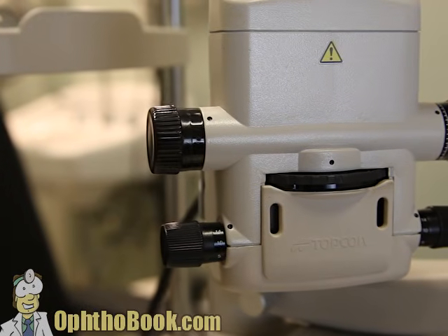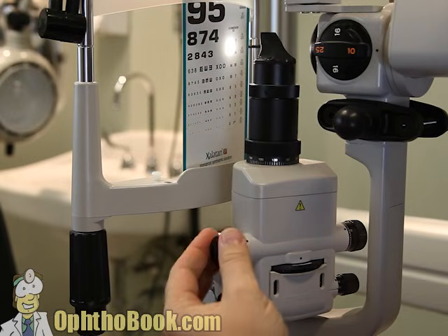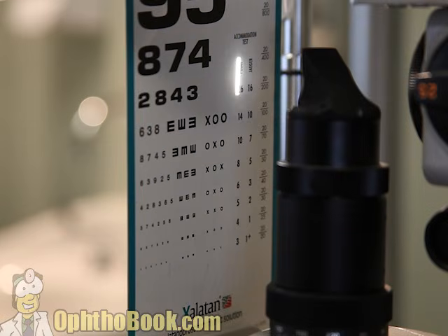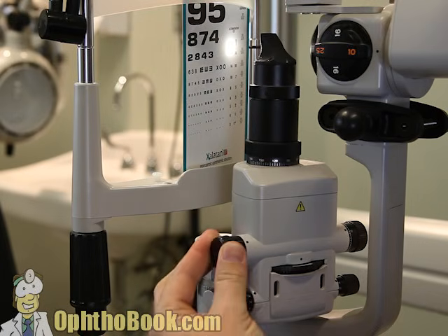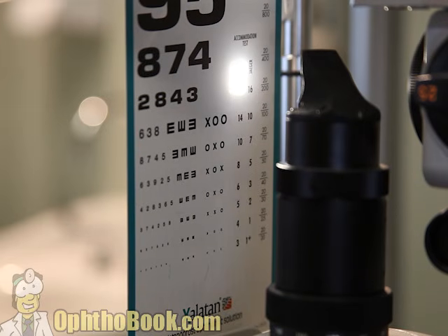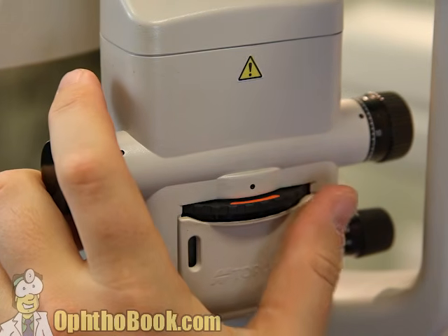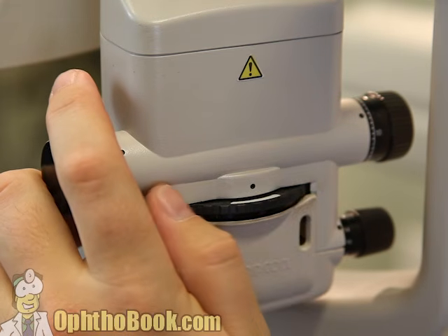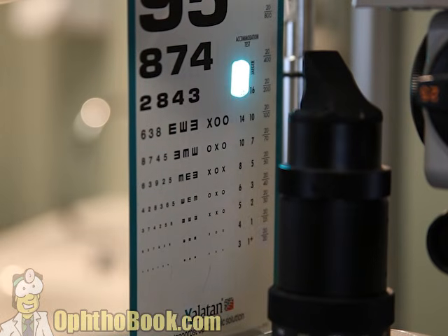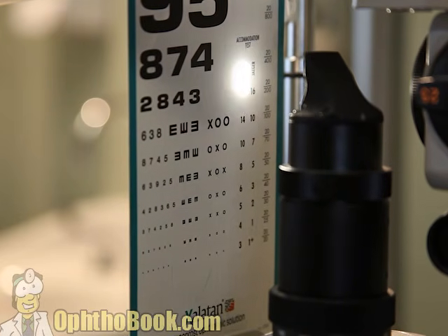We need to familiarize ourselves with the various knobs and dials. These are all in the same place, but one knob controls the width of light, which is probably the most useful control in our entire assembly here. Another one controls the height, not nearly as useful, but it is very helpful when measuring the size of objects. And then we need to find our various filters, and we'll cycle through these as well. And we're going to talk about this near the end of this particular lecture. But you can see here we've got green, white, and of course the blue light, which we use most often.